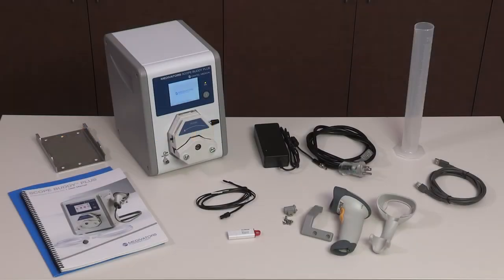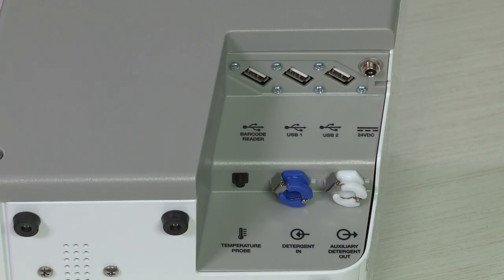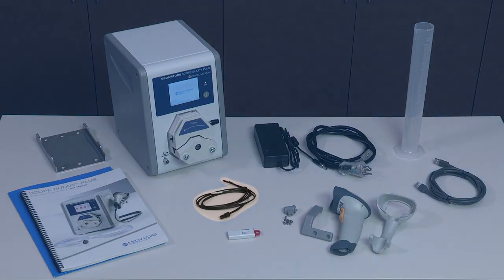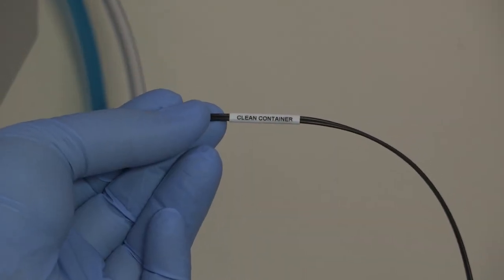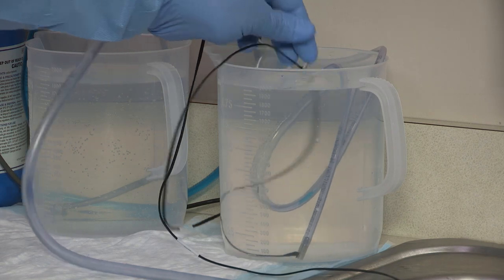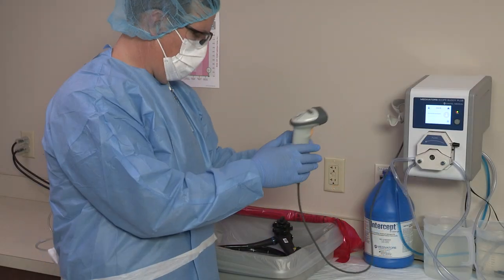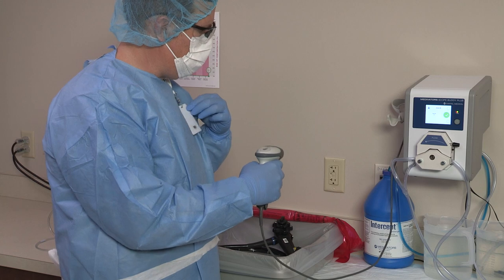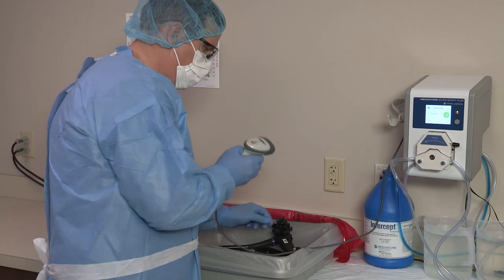The Scope Buddy Plus Flushing Aid combines an external peristaltic pump, color LCD touchscreen, and electronic controls to pump fluids through tubing connections to the channels of the endoscope. Components include a temperature probe with two sensors, which allows the device to show a warning if the temperature of the cleaning solution in the sink or clean container is outside the selected operating range. A barcode scanner and bracket provide easy, automated entry for user IDs, endoscope IDs, optional patient IDs, and tracking of detergent lot numbers.